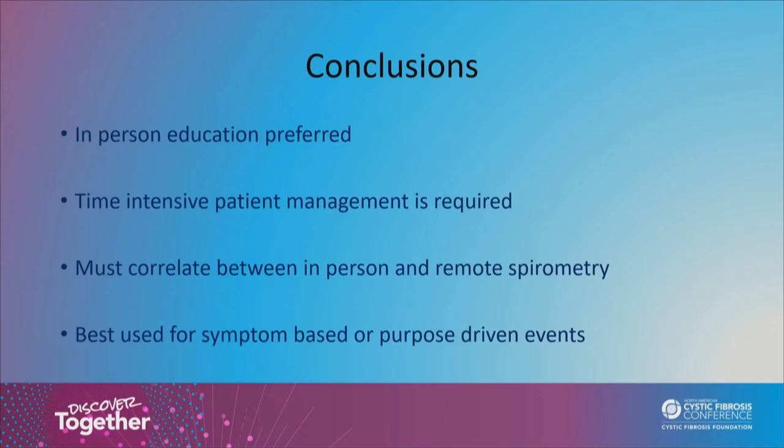Correlate between your most recent lab results and in-person spirometry and remote spirometry. And it's really best used for what I call a purpose-driven event. There's something that's happened, and we're responding to that, and one of the tools that we're going to use is home spirometry.